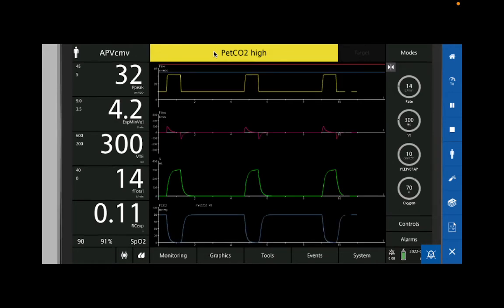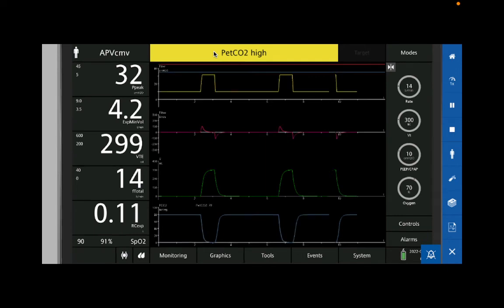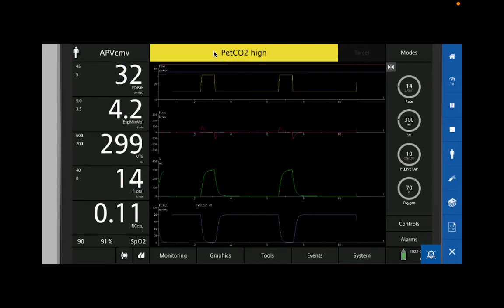All right, this one's our fault. We have to do something. So what do we do? But shouldn't 14 be an adequate rate for a patient? It should. Why is it not for this guy? There are 2 reasons.